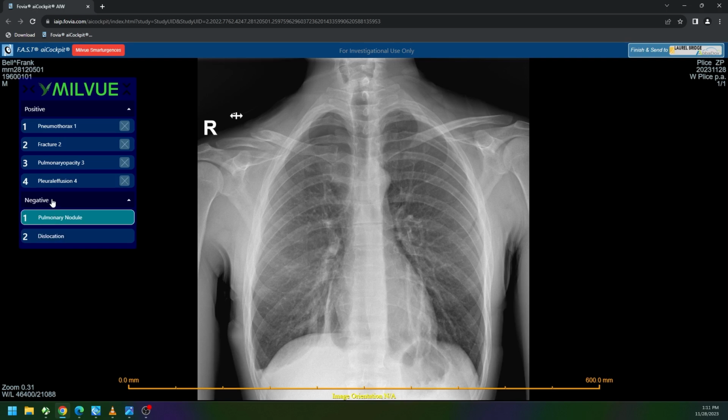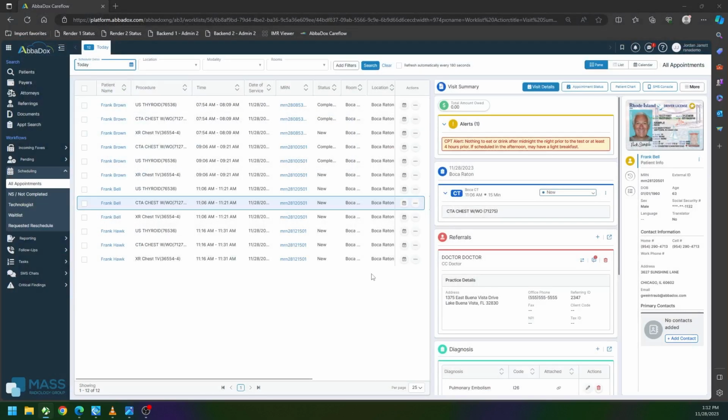The clinical team receives information about the report and subsequently inserts a chest tube. Frank initially improves and the chest tube is removed, but then he develops shortness of breath and hypoxia prior to discharge. Given his clinical condition, the team orders a chest CT with the pulmonary embolism protocol.